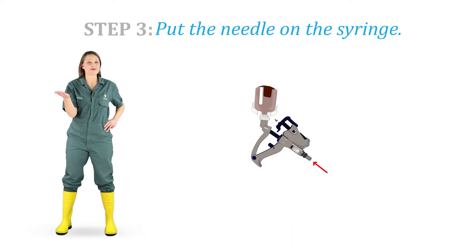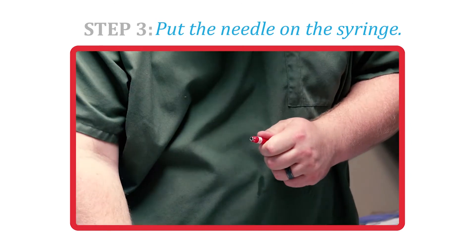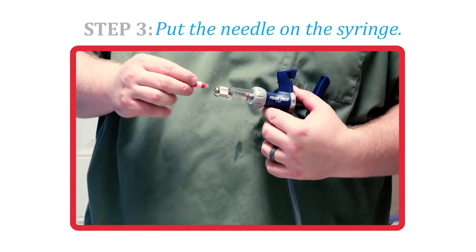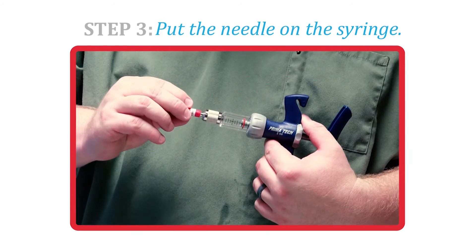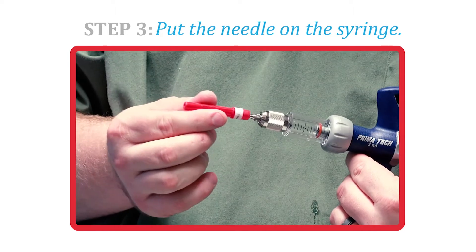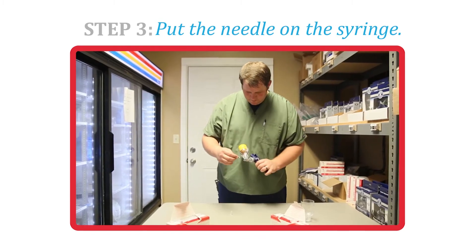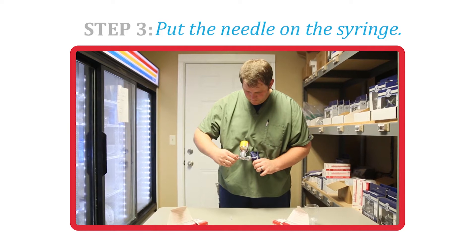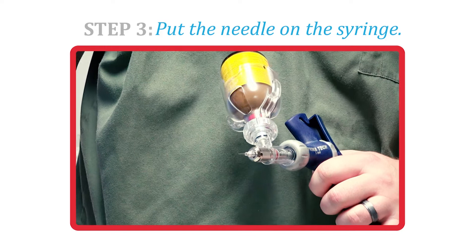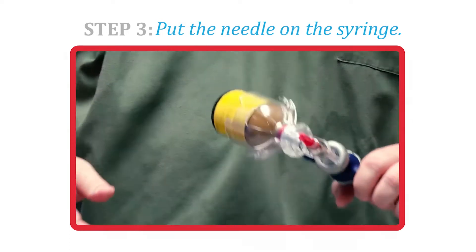Step 3. Put the needle on the syringe. First unscrew the cap, then leaving the cap over the sharp end of the needle, screw the needle onto the syringe. Each farm may have a different protocol for when to change needles — for example, between each litter or pen, or not until the vaccine bottle is changed. Always follow your vet's instructions depending on the health protocol at the farm you're working on.